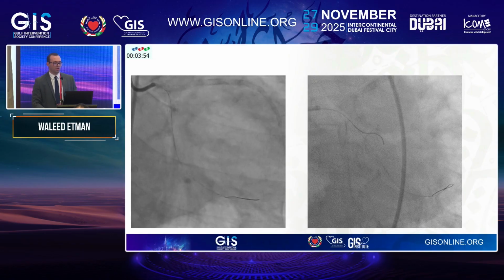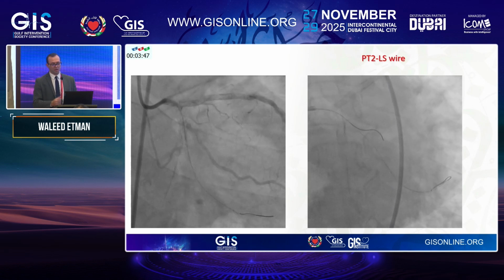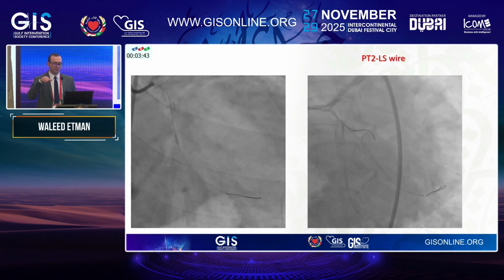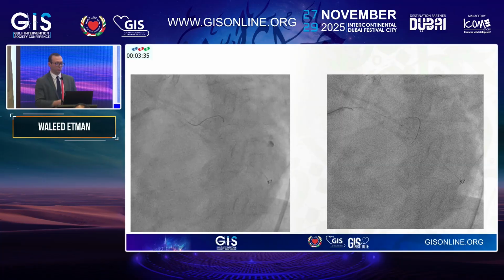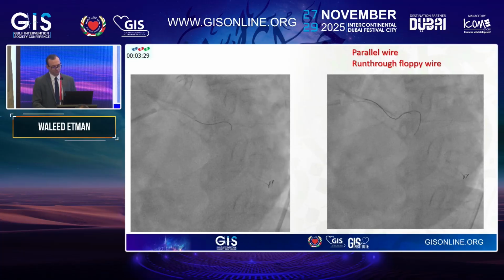Then I thought that I might use an anchor balloon technique. So I decided to wire the obtuse marginal. I brought a Pilot 200 wire. However, the wire didn't pass easily in the obtuse marginal. It kept on going in this branch. While doing some manipulations, I think that we dissected the obtuse marginal and there was some flow lost. So I kept the wire in place. I used another wire, a Runthrough wire, which passed easily, after some manipulation in the obtuse marginal.